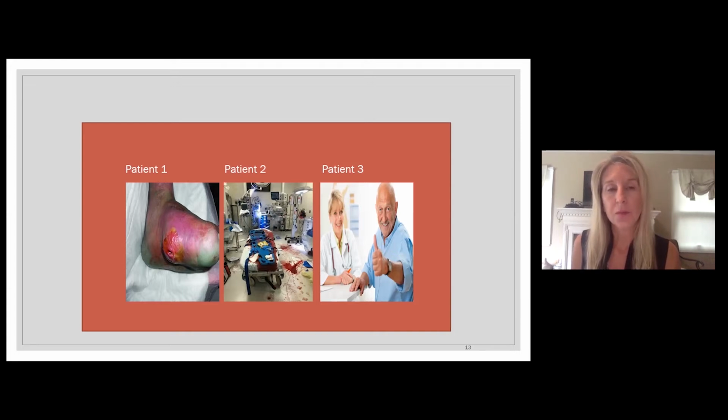But remember, this patient, he was 25, he was young, he had a very healthy heart. He was vasoconstricting and doing a lot of things to maintain his mean arterial pressure. And if I didn't have access to those additional hemodynamic parameters, I most definitely think he would have fallen off the cliff, as I like to say. So we were able to get him to the OR quickly.